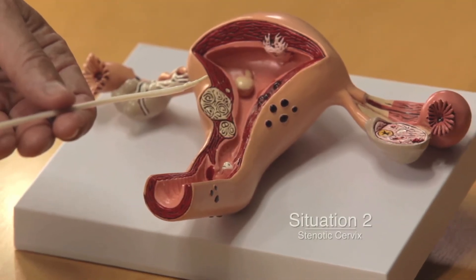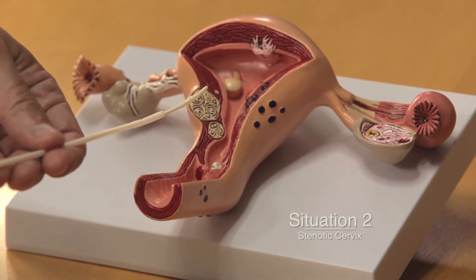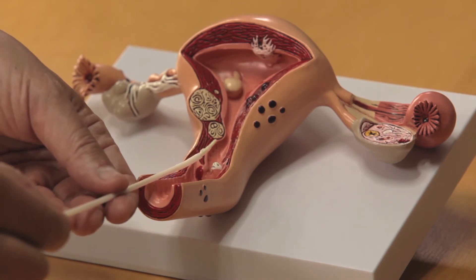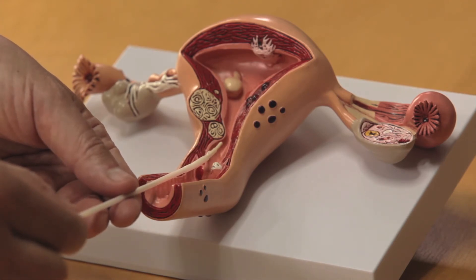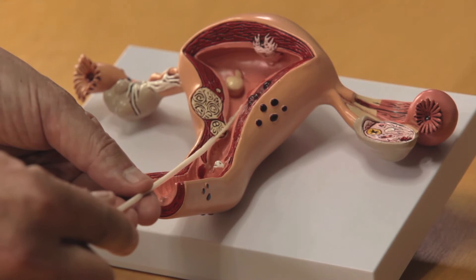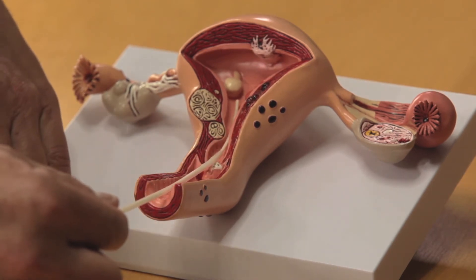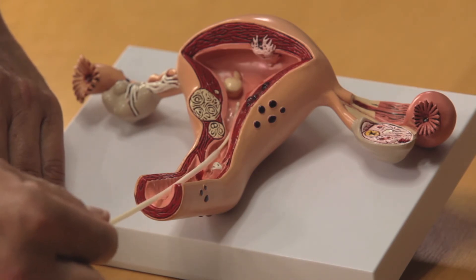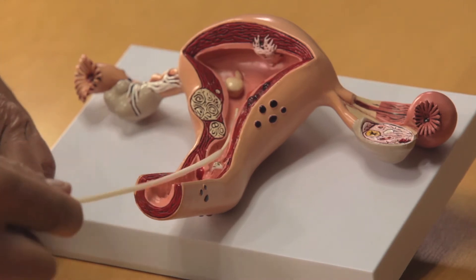Situation number two: you're dealing with a patient who has a rather stenotic cervix. We bring our sheath to the tip to give it stability, then bring the sheath and the soft tip forward. Once we reach the endocervix, we can advance our catheter — and voila, the balloon is placed. One cannot do that with current catheters because the diameter of the sheath is too big to allow entrance into the endocervix.